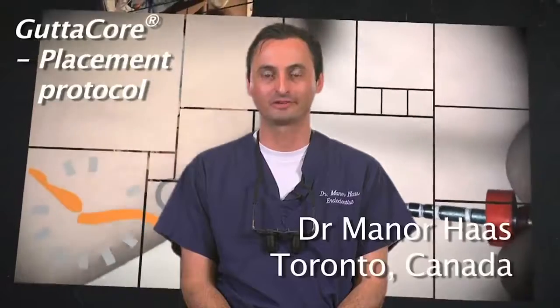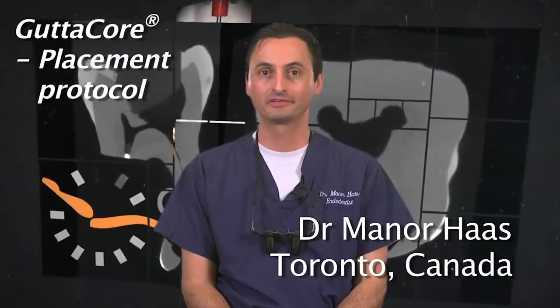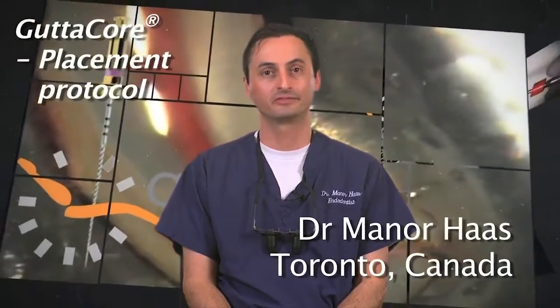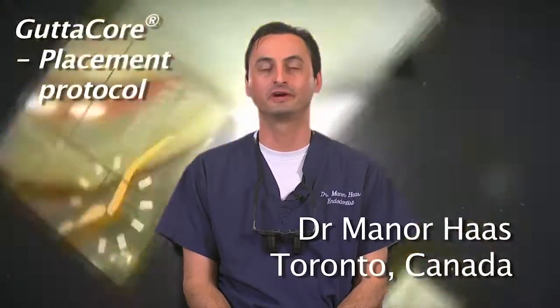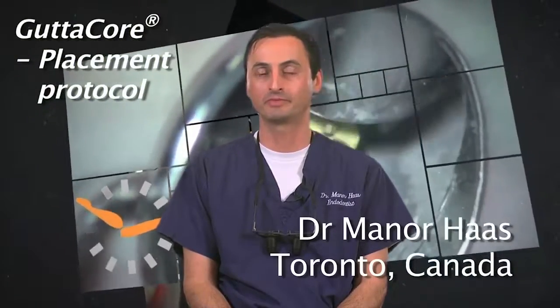Hello, I'm Dr. Manor Haas, a certified endodontist from Toronto, Canada. In this segment, I would like to review the delivery of GuttaCore into the canals. This important step is easier than you might think, especially when the canals and pulp chamber are prepared, as discussed in my other segments. By now you've easily used your size verifier and lined the canal walls with a bit of sealer, which means you're ready to obturate.